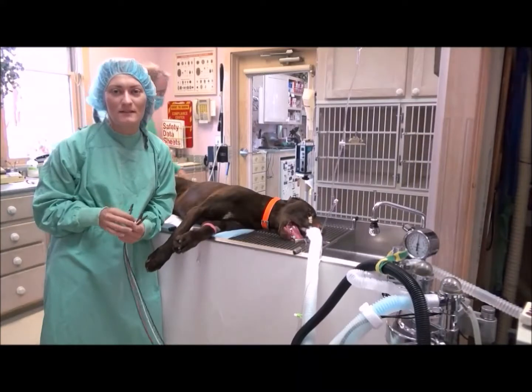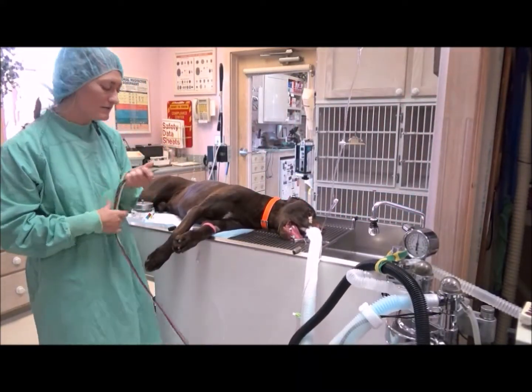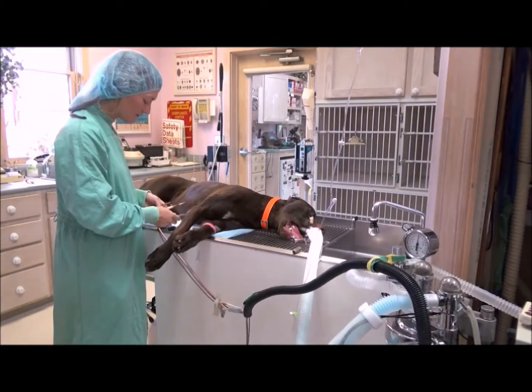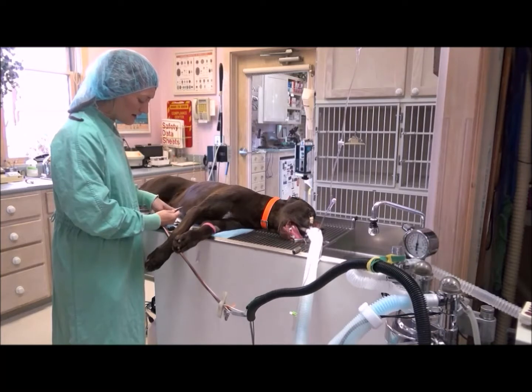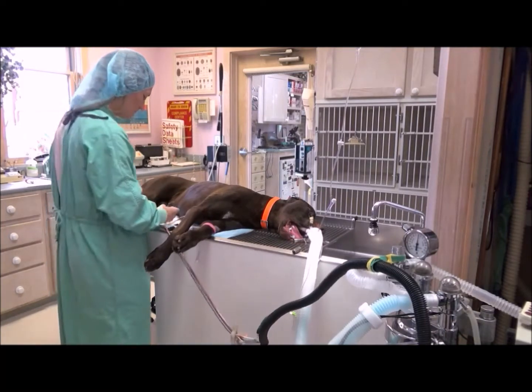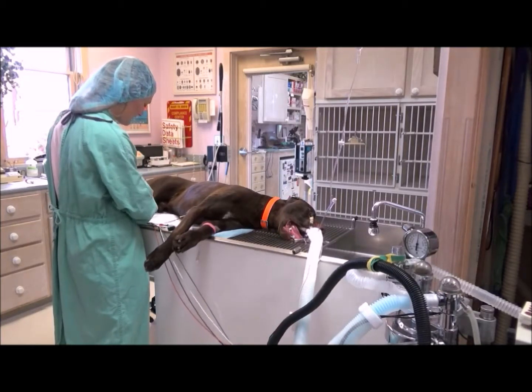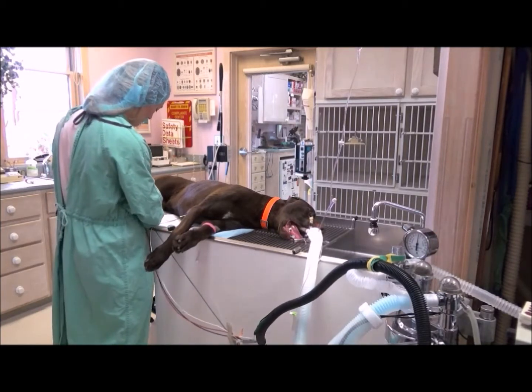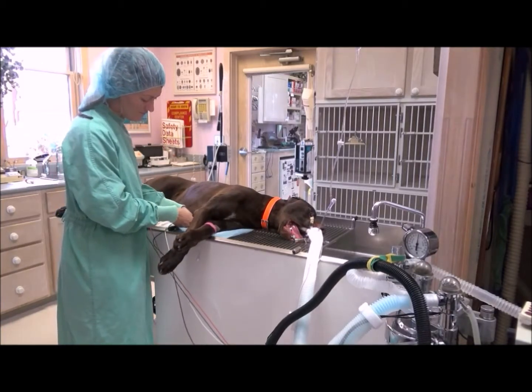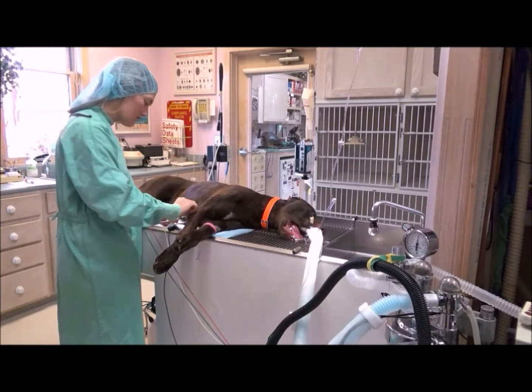I'll start by placing the EKG leads. The electrocardiogram detects the electrical impulses from the cardiac conduction system. I remember it as green and white are always right. And Christmas comes at the end of the year, so red and green are at the rear. And then you have to moisten each of the leads with alcohol.